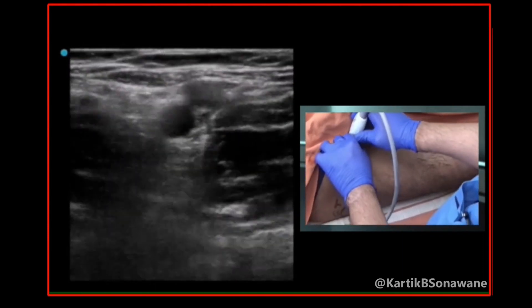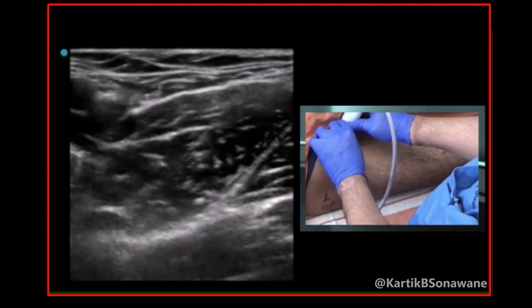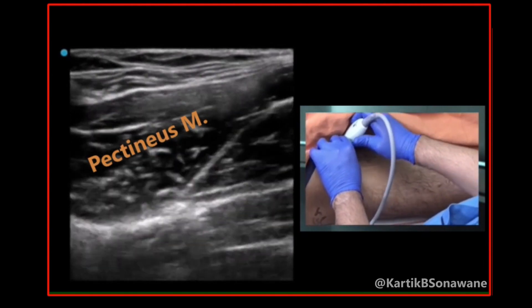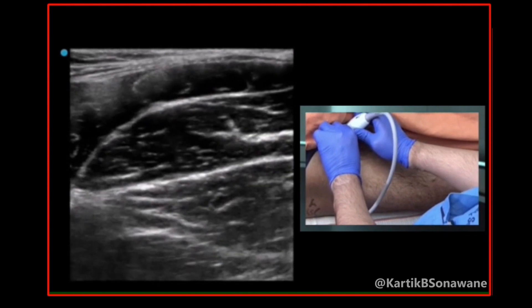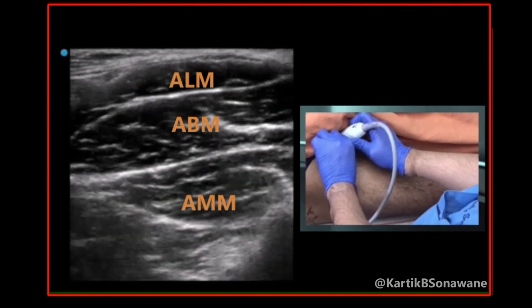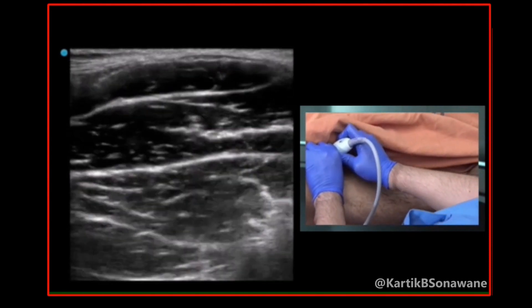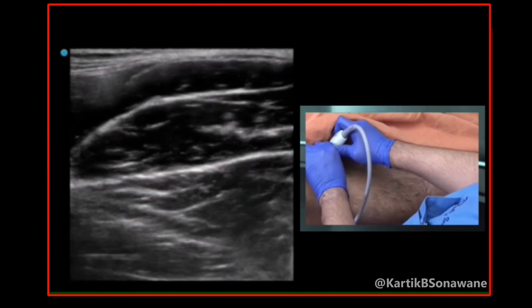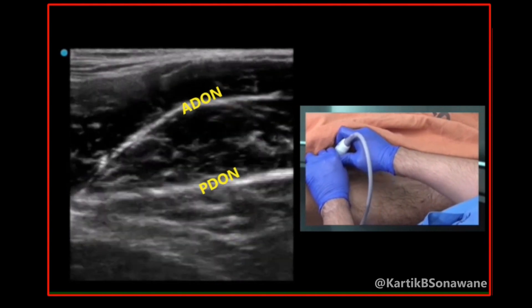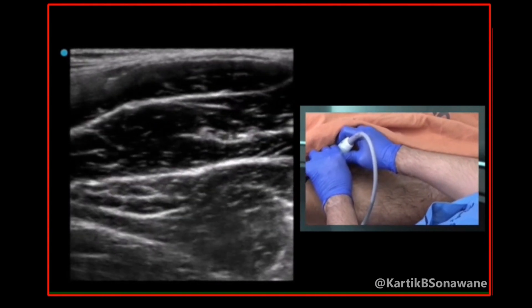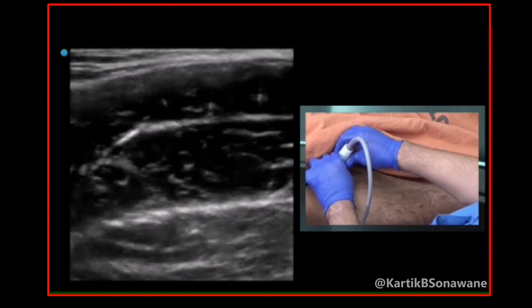Keeping the probe over the inguinal crease and moving further medially, you can first see the femoral vein, then the loop-like muscle which is the pectineus muscle. Moving further medially, with the probe on the medial aspect of the thigh over the inguinal crease, you can see three muscles: adductor longus, adductor brevis, and adductor magnus. In between these three muscles you can see the hyperechoic anterior division and posterior division of the obturator nerve. Now we'll look at the hypoechoic adductor longus muscle and trace it distally.